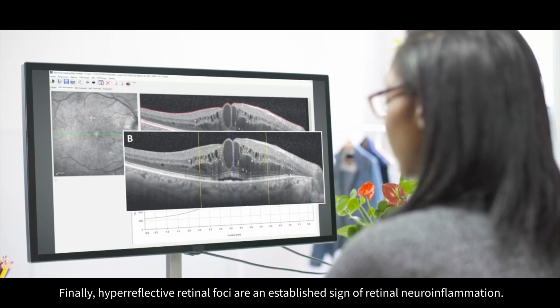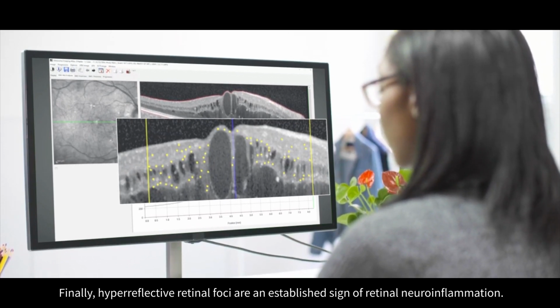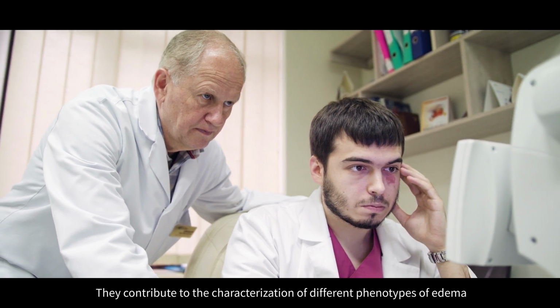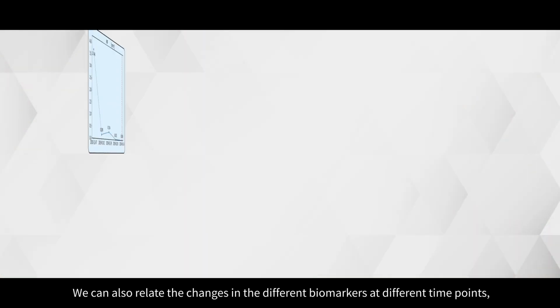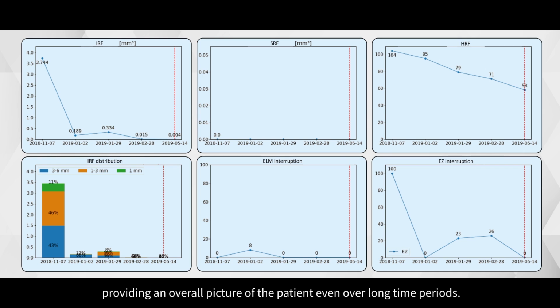Finally, hyperreflective retinal foci are an established sign of retinal neuroinflammation. They contribute to the characterization of different phenotypes of edema and require different treatments. We can also relate the changes in the different biomarkers at different time points and visualize intuitive graphs of the progression of the edema over time, providing an overall picture of the patient even over long time periods.